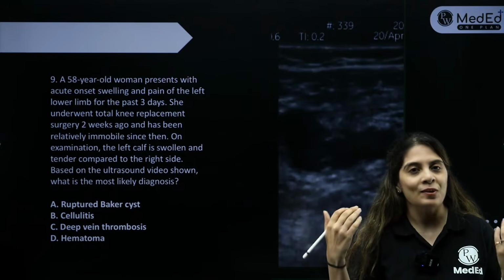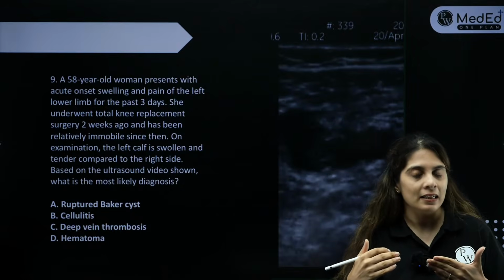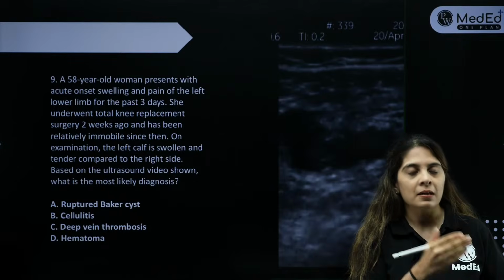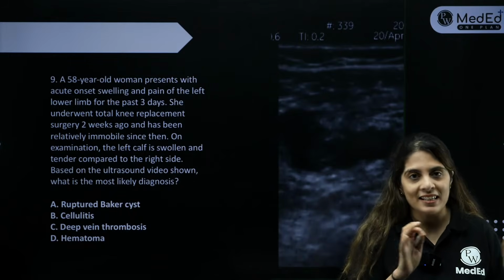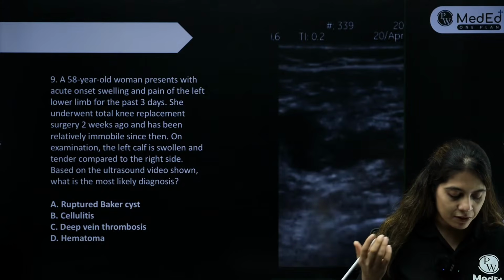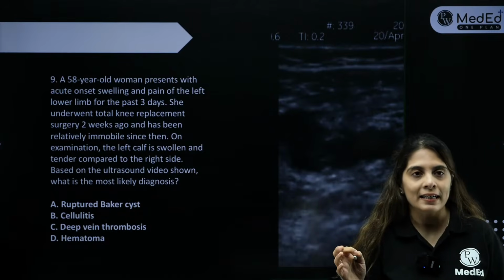Your examiners may not be so easy on you. They may not give you so many clinical hints in the question, but my point is that any one of these clinical hints can be given to you along with the video. That is why I have included all the points in the question. On examination, the left calf is swollen and tender compared to the right side. Based on the ultrasound video shown, what is the most likely diagnosis?